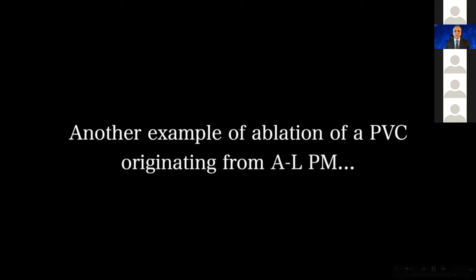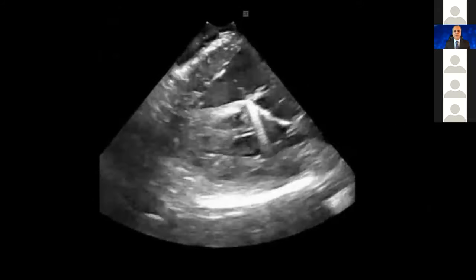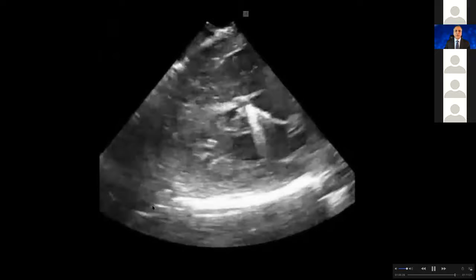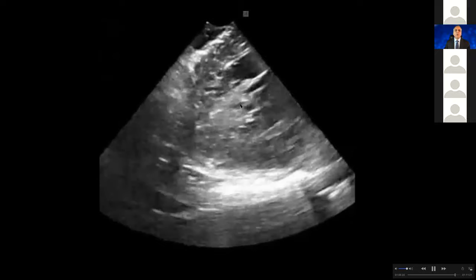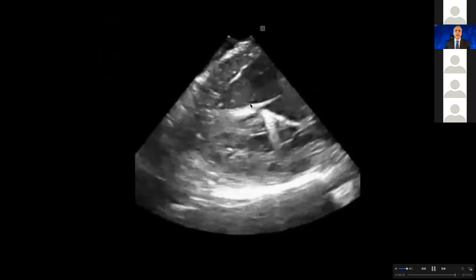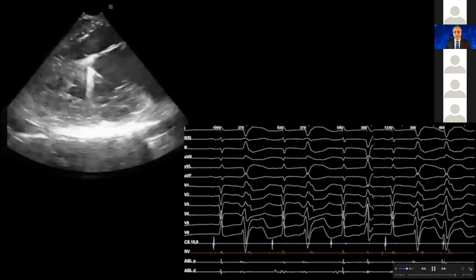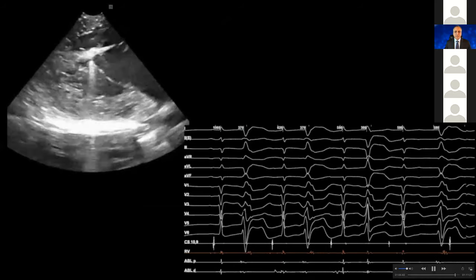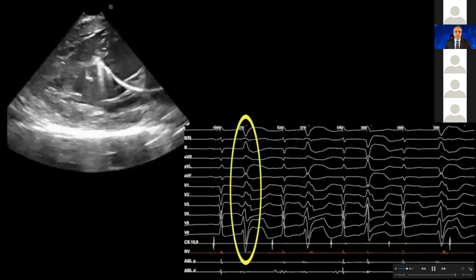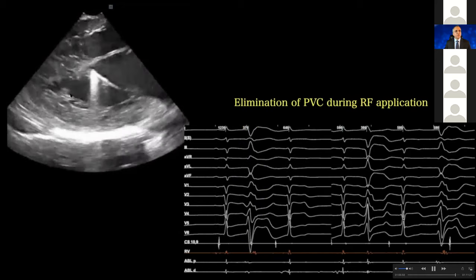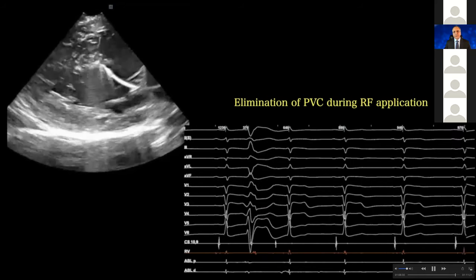Another example of ablation of a PVC originating from the anterolateral papillary muscle. You can appreciate that this patient is in ventricular bigeminy. You can see the junction of the chordae and the papillary muscle — the PVC is coming from here. I have gone antegrade, and here you can appreciate that this is that very PVC. In V1 and V2 there is an M shape, and leads 2, 3, AVF are positive, so this was coming from this very spot. We had very good contact.